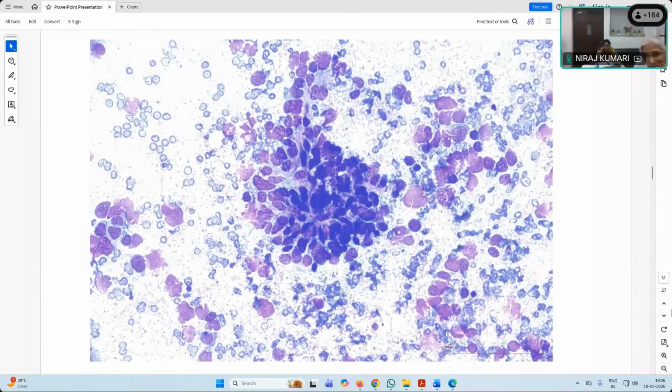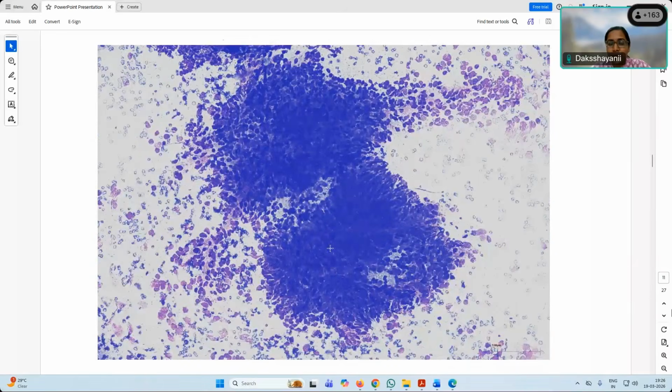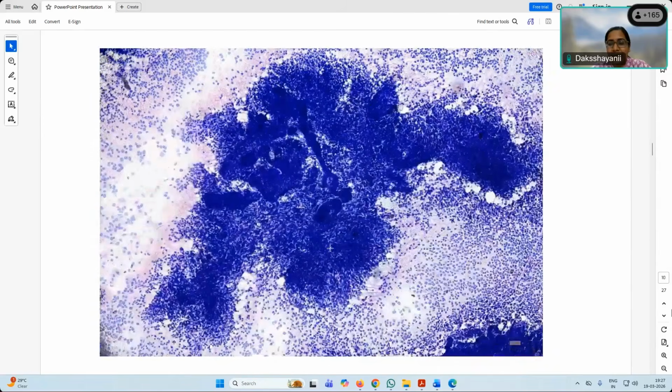The blastemal cells are usually discrete with scant cytoplasm and round nuclei, whereas epithelial cells are usually arranged in a rosetteoid pattern with moderate cytoplasm, ma'am. Sometimes you can also see glomeruloid structures or tubules also. And stromal cells will be seen, which are again seen discretely, spindle-shaped cells.